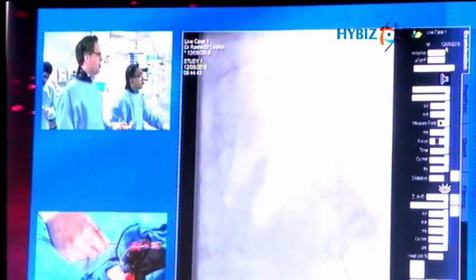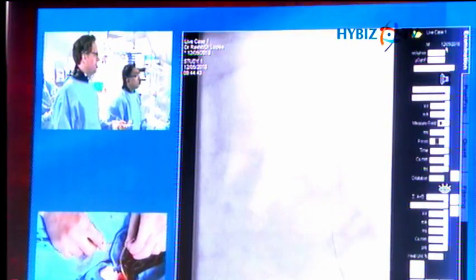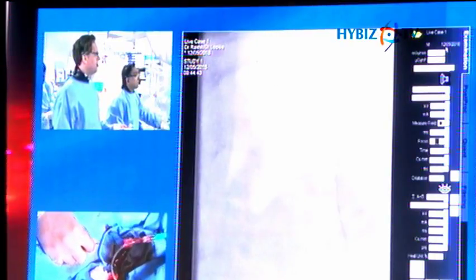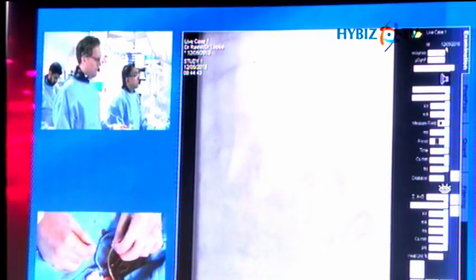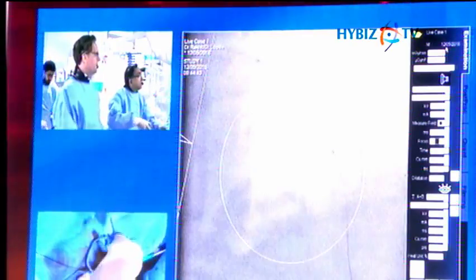It's the usual things. You'd be very, very careful when you're advancing it, especially such a long one. You'll see it's very, very stiff. We're lucky here because there's a nice run in, and it looks deliverable. But it's a very stiff device, so it can be tricky to deliver, obviously because it's quite bulky. Also, the normal care about air entrapment. And once you dilate, you don't need to go to super high atmospheres. You just dilate slowly and steadily.